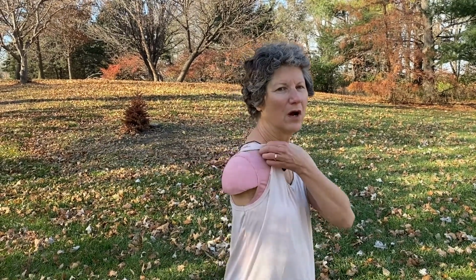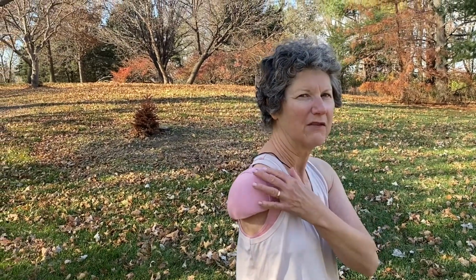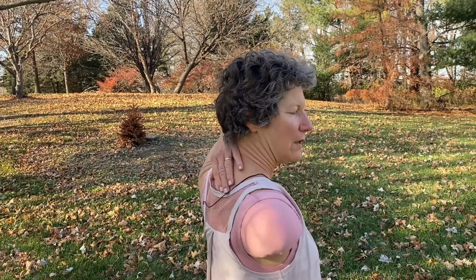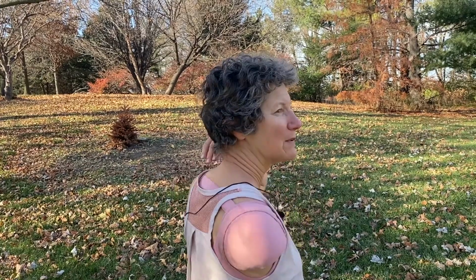So putting all these ideas together and trial and error, this is what we came up with. It is attached to my bra. There's shoulder pads that flare out that give me the semblance of a shoulder. This adds a lot of weight to the strap, so we figured that we needed to add a strap back here between the straps of the bra to keep it in place where my shoulder is supposed to be. So next, let's get started. I'll tell you all the steps about how to make a do-it-yourself shoulder prosthesis.